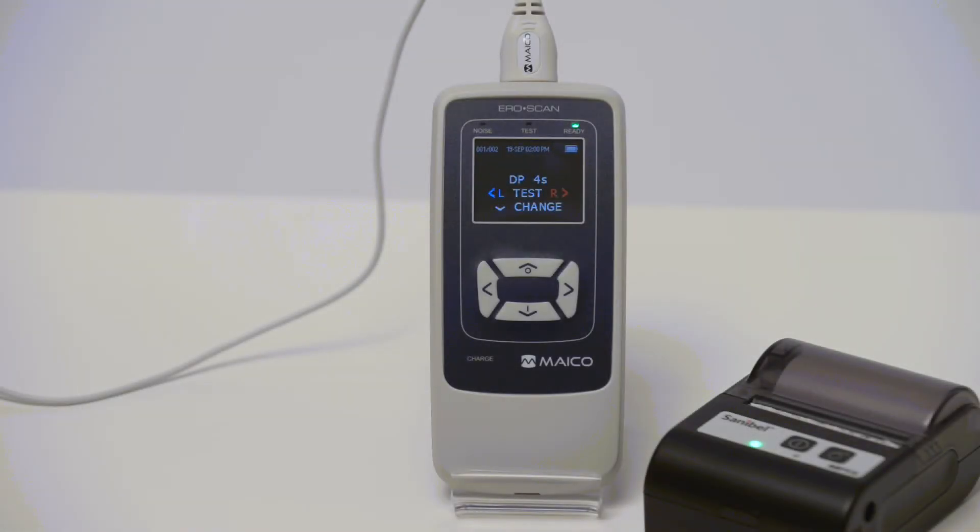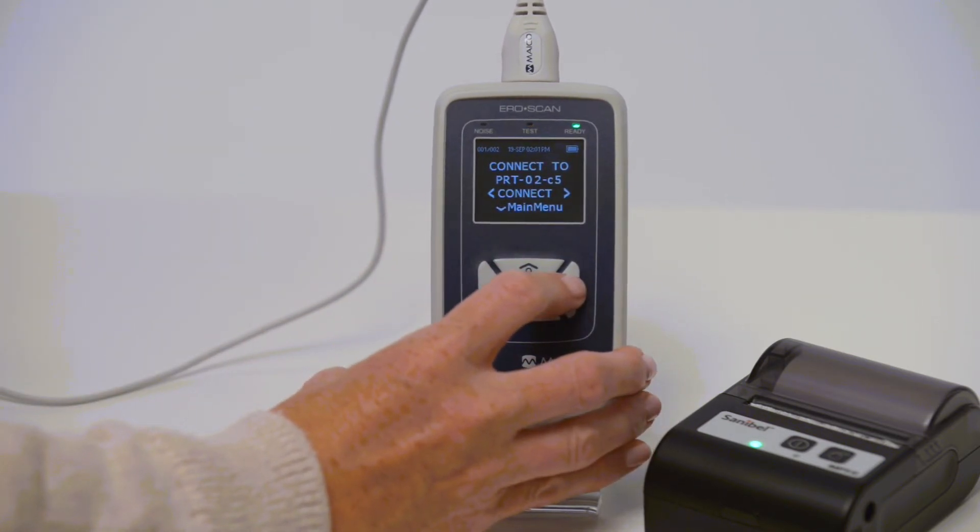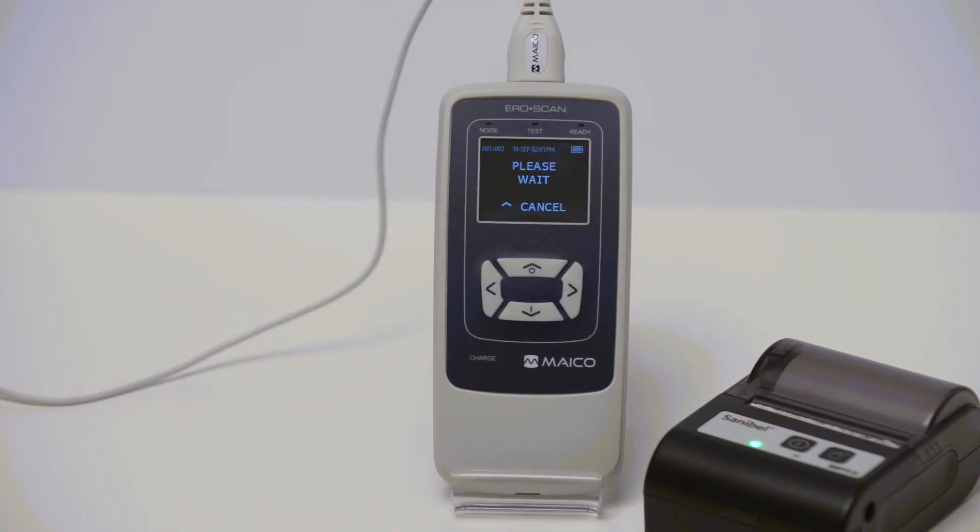To print results on the wireless printer, turn the printer on and press the up arrow until the printing screen is displayed. Press the left or right arrow and results will print.